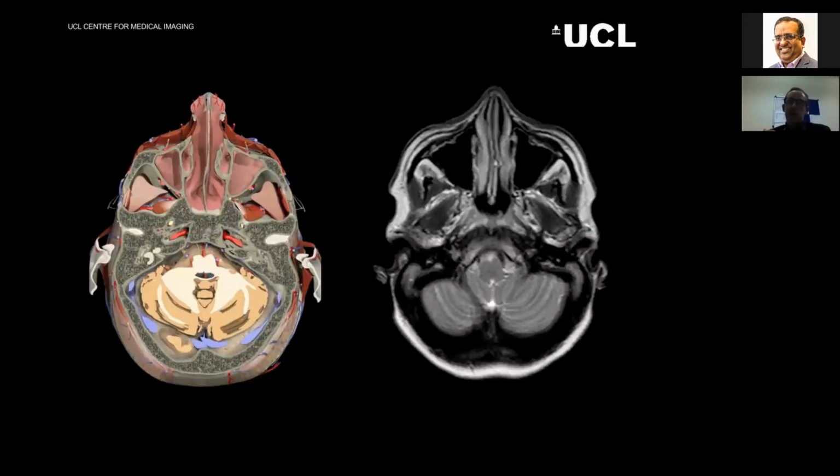Because in clinical practice, we're presented with a number of different sequences, and we have the luxury of time and also sequences to put a picture together. In the exam, you have neither of those luxuries. And I'll give you an example. In one of my vivas, I had an epidermoid cyst at the cerebellopontine angle, and what they wanted to know was what would be the next sequence that I wanted. They were looking for diffusion weighted imaging, or ADC, and what the imaging characteristics would be. Now, they didn't show me that imaging because I answered the question already, but that's the sort of thing they're looking for, your preemptive lateral thinking on how this is going to go.